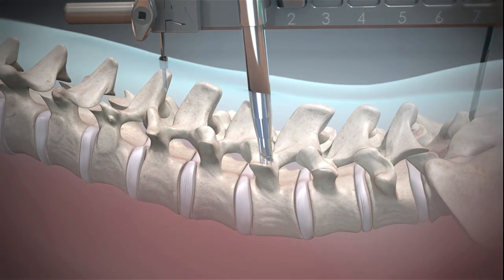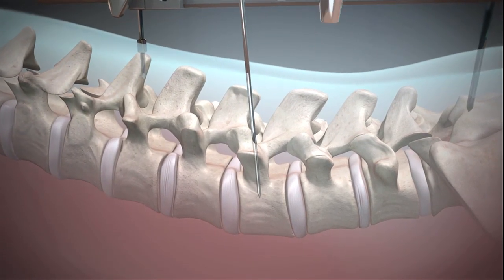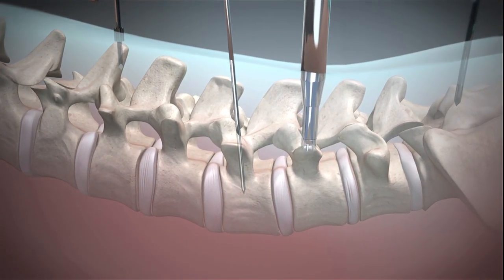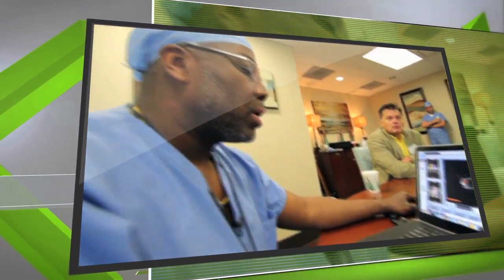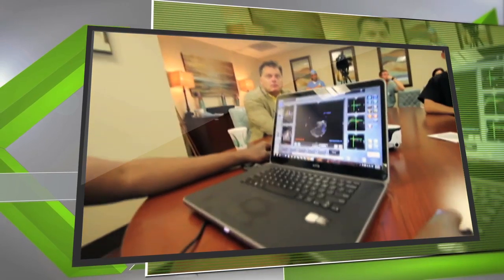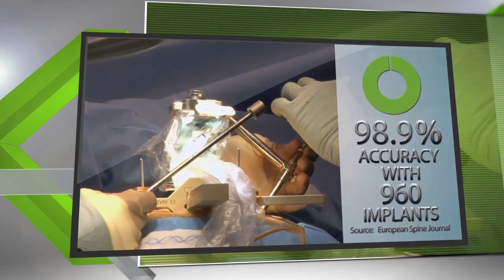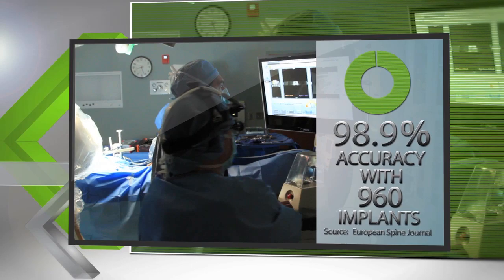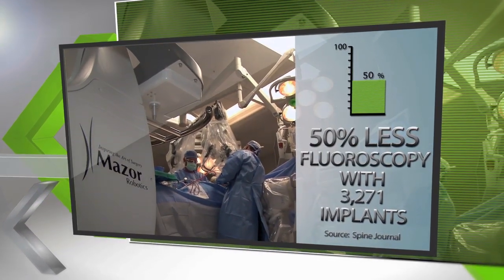This process continues until all trajectories have been executed and implants are safely placed in the planned location. With Renaissance, surgeons can enjoy the comfort of preplanning their surgery, executing the procedure with unparalleled accuracy, and a safer OR environment, with the potential of using less fluoroscopy.